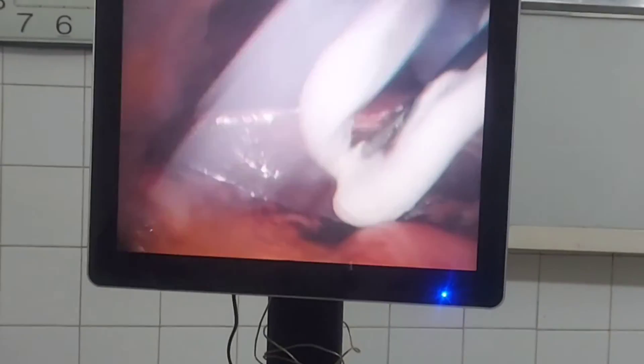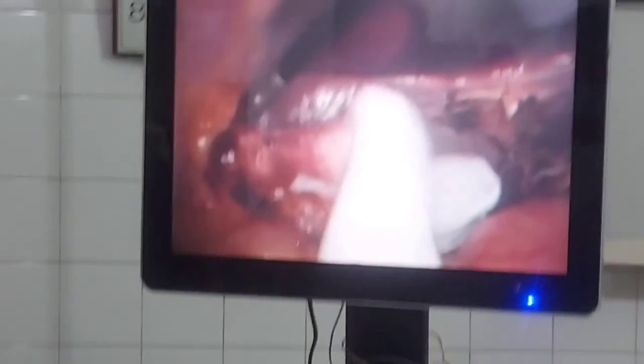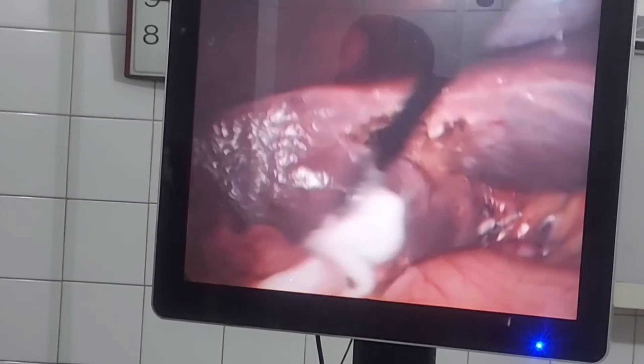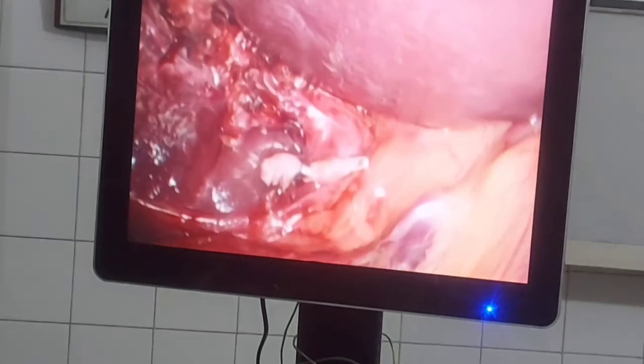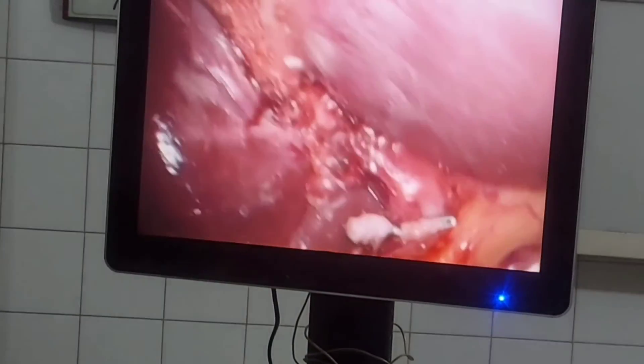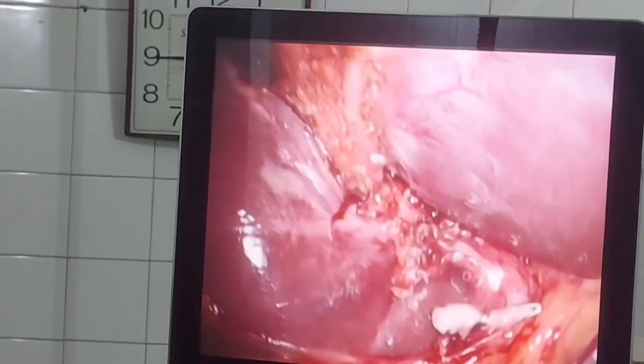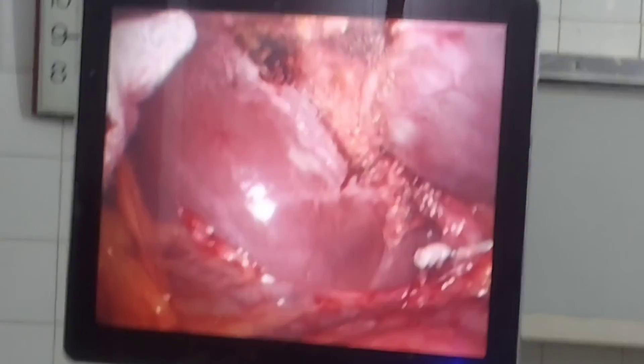A small piece of surgical gauze is used to mop the area, and cauterization is performed if needed. In this operation, we have not placed a drain in the sub-hepatic area because there was no ooze over the surgical site. However, if a drain is placed, it should not be a suction drain and should be placed through the 5 millimeter port site.